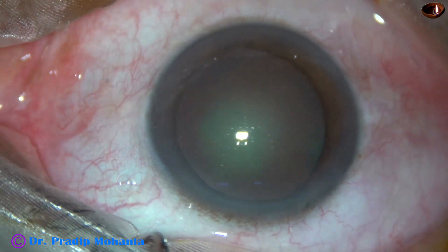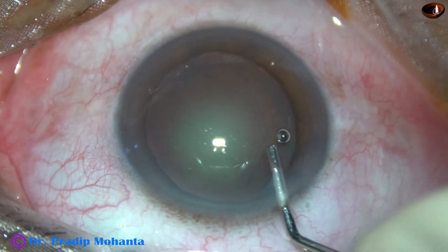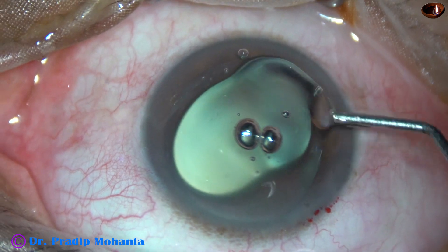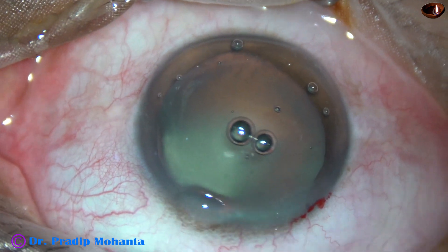This is the main incision with a 2.8 millimeter steel keratome, and now the anterior chamber is filled up with 2% HPMC and it is applied over the cornea for better visibility.